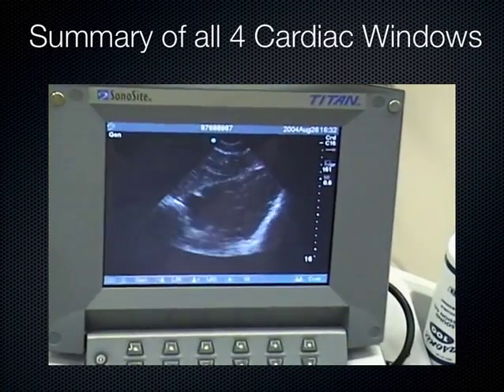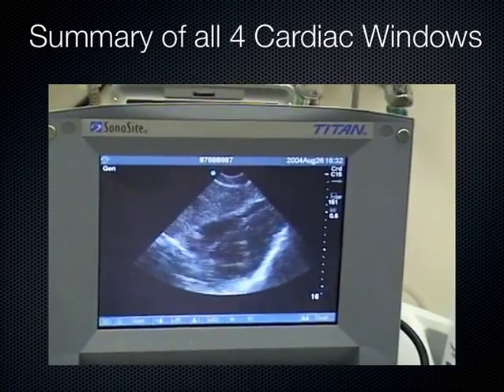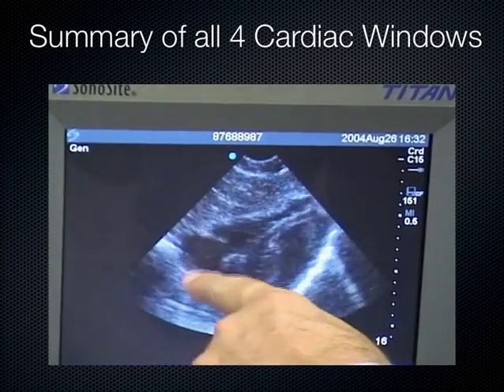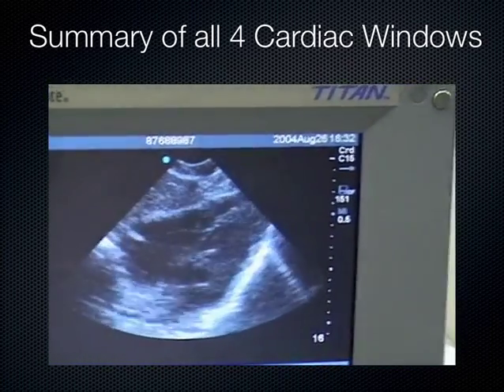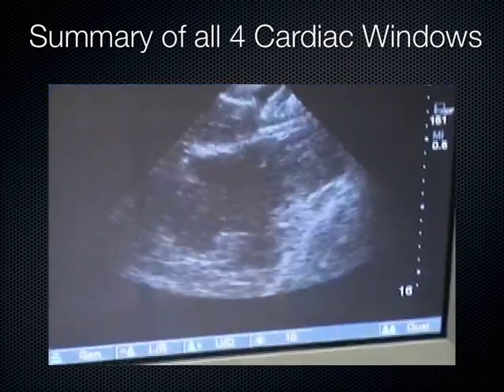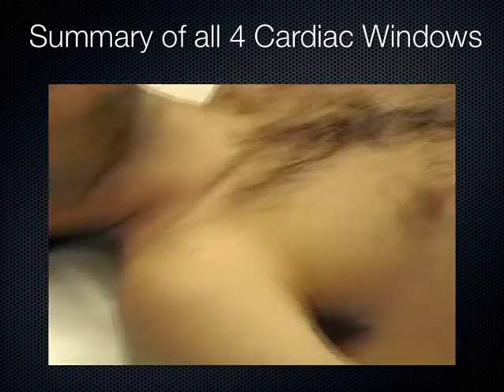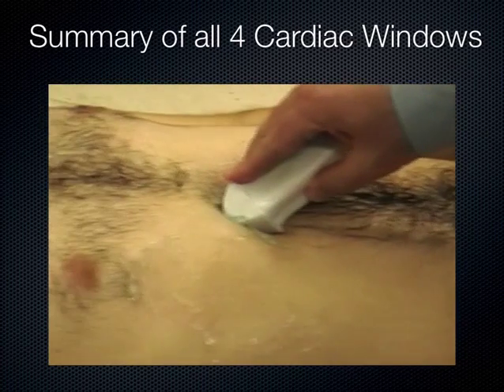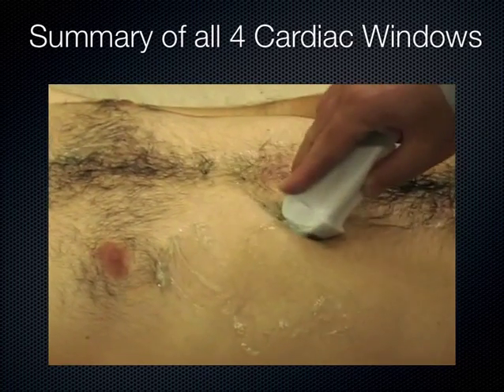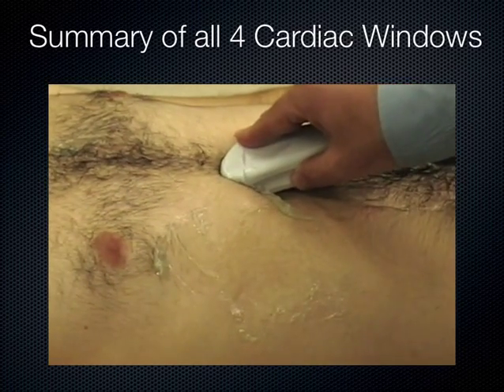And the screen looks a little dark to me. I'm going to turn up the gain a little bit here now. And what we're looking at here, this is the right ventricle, right atrium, left atrium, and there's the septum. This is just a very quick overview to get your feet wet. So that's a subcostal view. Again, if you look at the probe here, the indicator is towards his right. I looked at the liver, and then I saw the heart. That's the way you do it. You start at the liver, you slide up into that fossa till you see the heart.